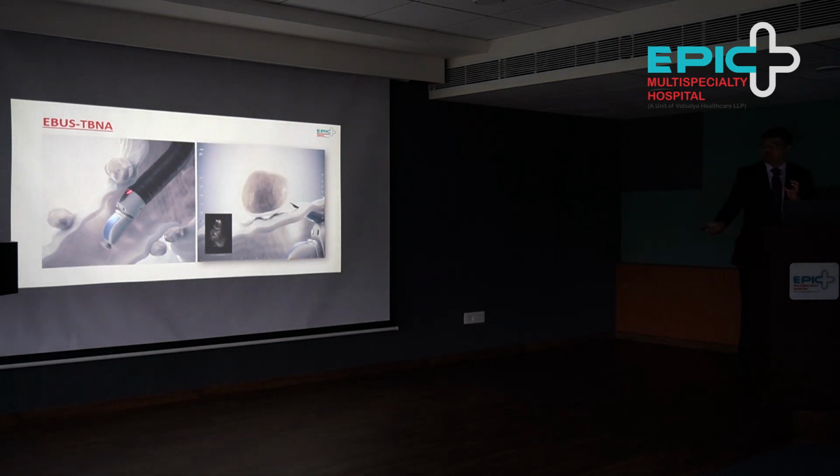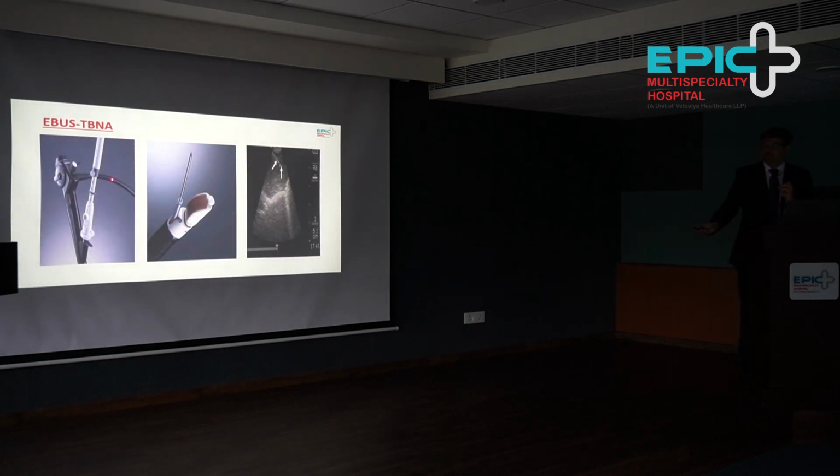So again, this is the trachea, these are the lymph nodes, and this is an EBUS scope which is going inside the tracheal lumen and can visualize. We have the image on our sonographic processor, and in real time, we can puncture the lymph node and get a good sample. So how do we do the sampling?